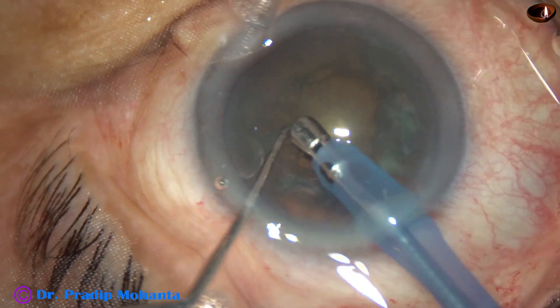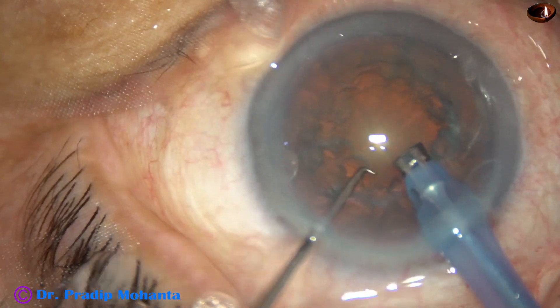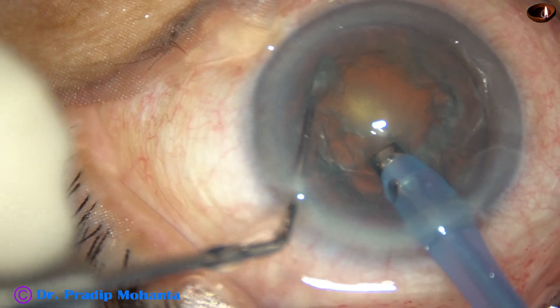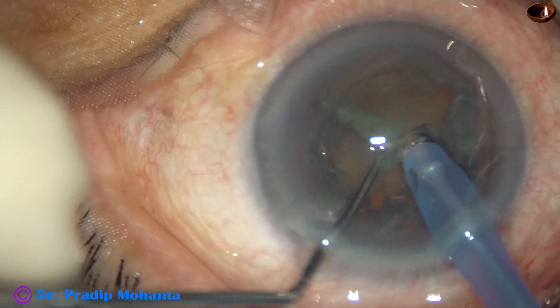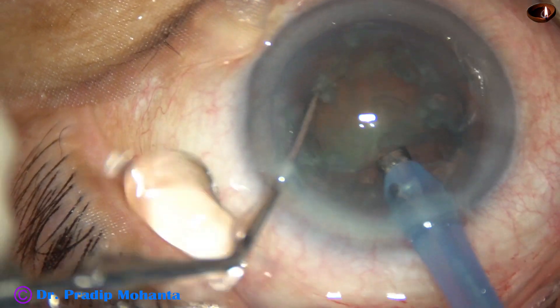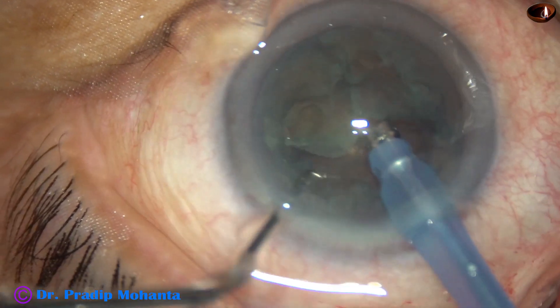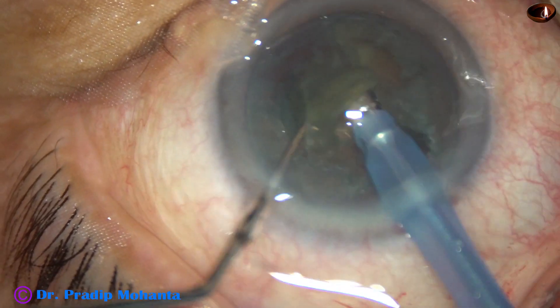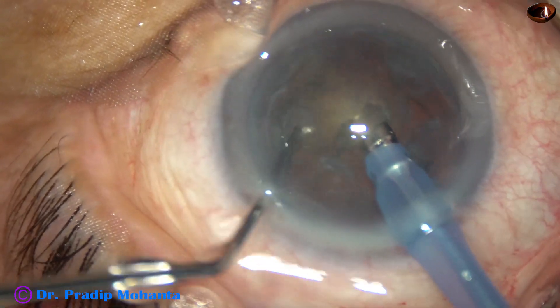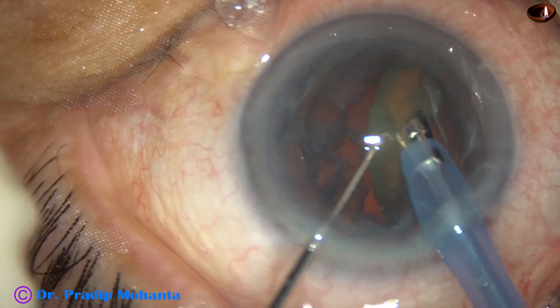I aspirate some cortex and a part of the epinucleus. Visibility becomes better. Now I go into the substance of the nucleus and do mechanical chop. I support the nucleus with the phaco handpiece and the chopper does the main job in mechanical chop. The phaco handpiece remains in irrigation and supports the lens mass.